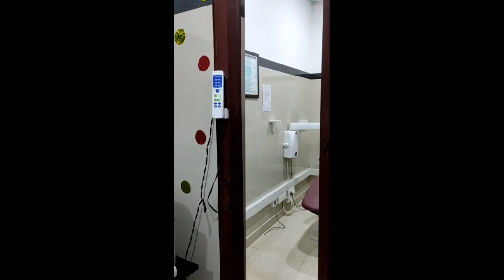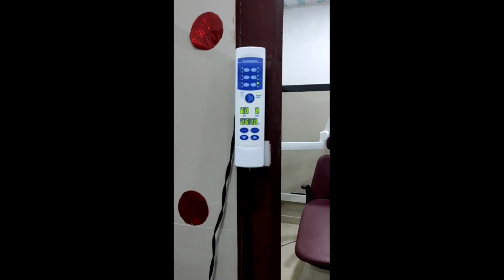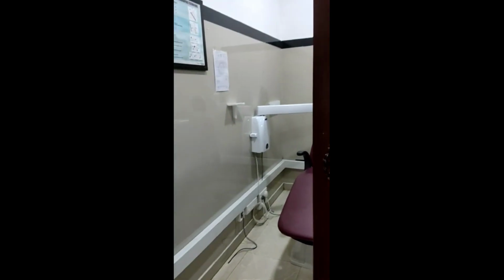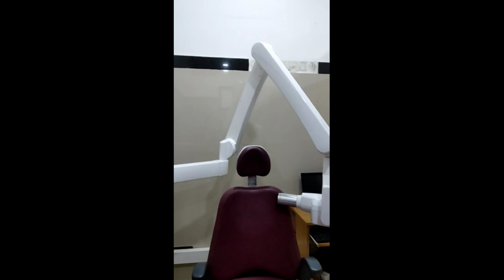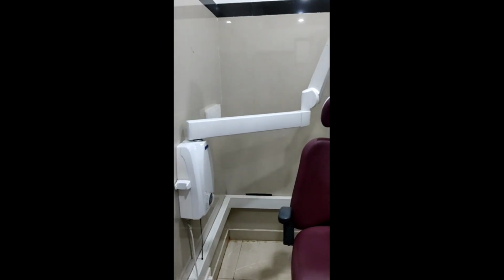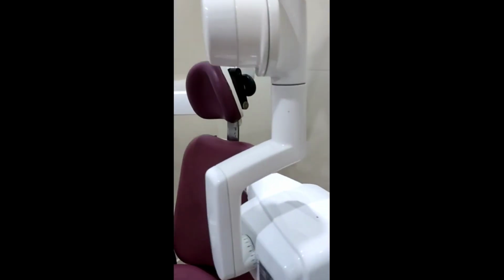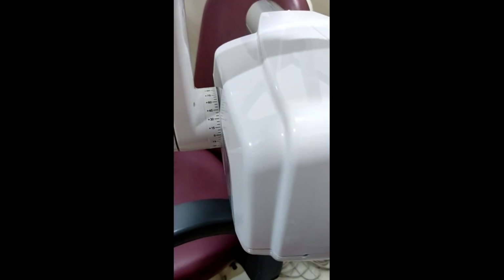Today's session is about the intraoral radiographic technique. So this is the control panel that you can see, where you can adjust the time period. And then we have the X-ray machine that you see here with the extension arm and the X-ray tube head. Once we switch on the machine, first and foremost what you have to do is adjust the time period that is required for the image to be taken. And then we adjust the angulation that you can see here.